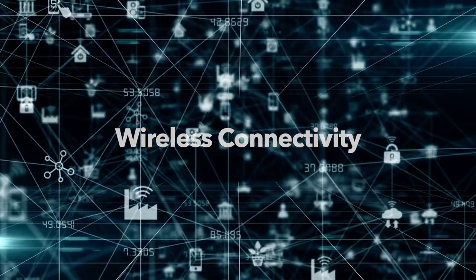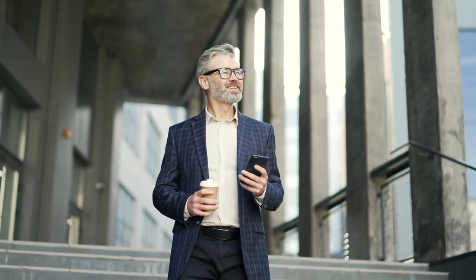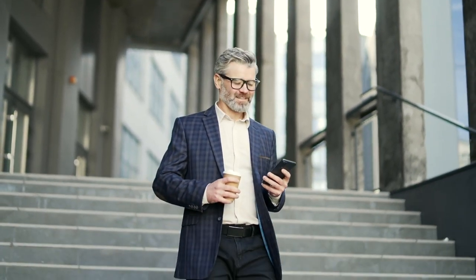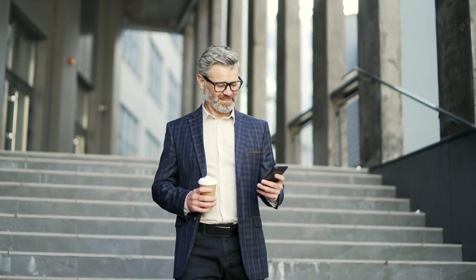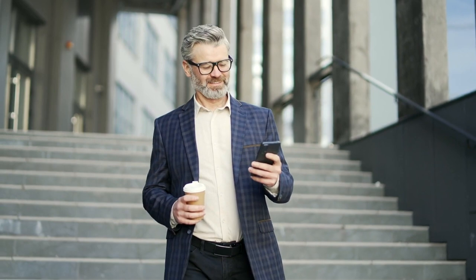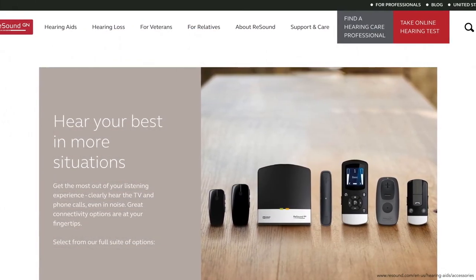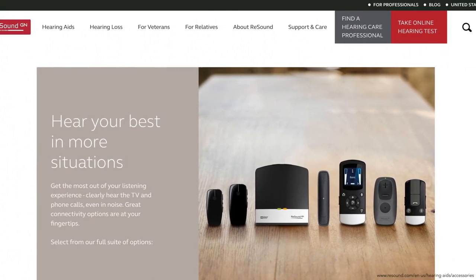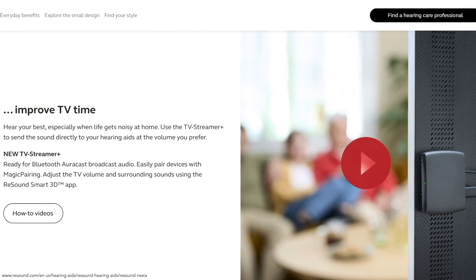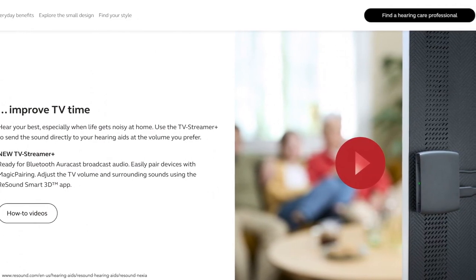The ReSound Nexia is made for iPhone and iPad so you can enjoy hands-free calls, and it's also compatible with certain Android devices. Stream all of your calls, media, and music directly to your hearing aids. If you still struggle to hear in noisy situations, you can connect to wireless microphones for improved clarity. Also try the TV Streamer Plus for better hearing on the television — it includes R-Cast technology.